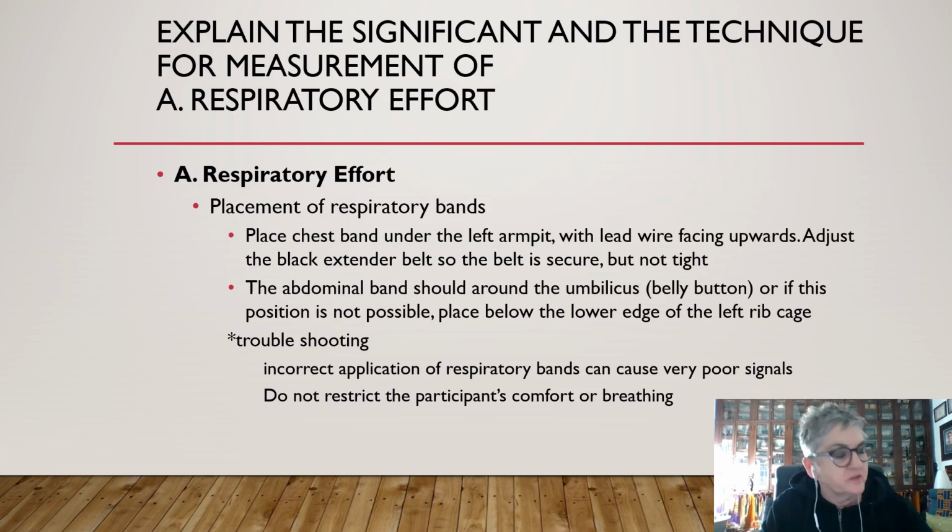We're going to move on to objective 2, which is to explain the significance and the technique for measurement of respiratory effort and SaO2. First, we're going to tackle respiratory effort and the significance of it.